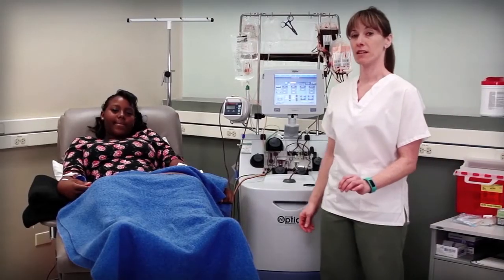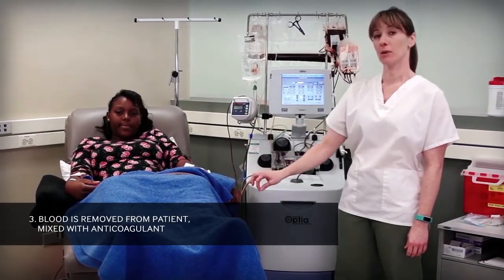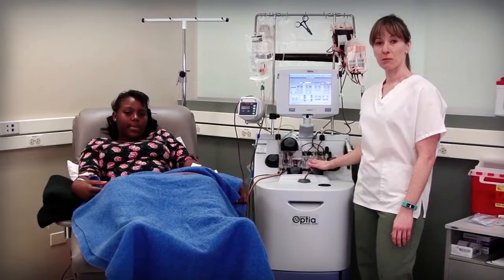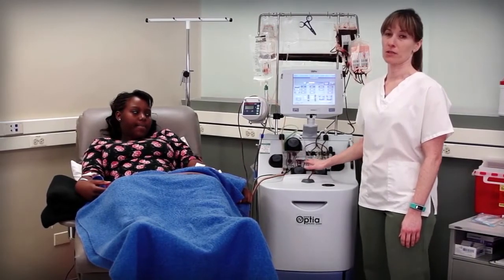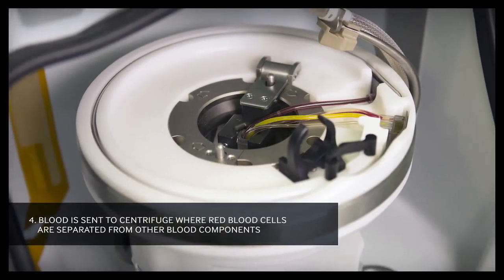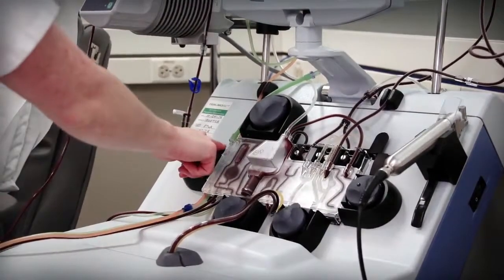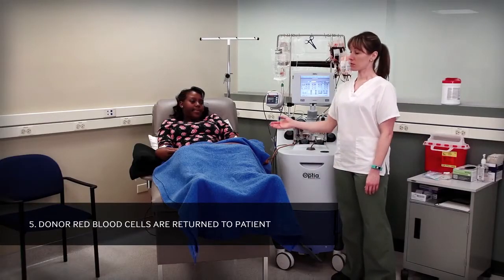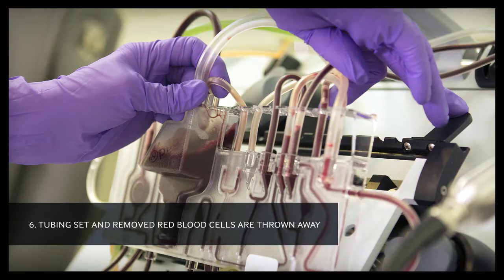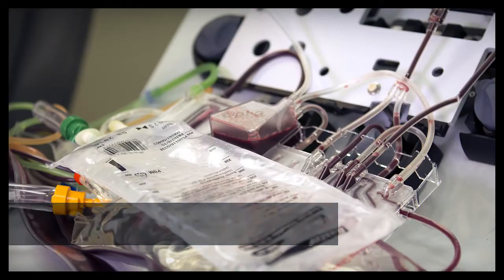Once the tubing set is connected, blood is removed from the patient and mixed with a fluid called anticoagulant, which prevents the blood from clotting. Less than a cup of blood is in the tubing set at any point during the procedure. Next, the blood is sent to the centrifuge, where the red blood cells are separated from the other blood components. The healthy donor red blood cells are returned to the patient, and when the procedure is complete, the tubing set and the red blood cells removed from the patient are thrown away.